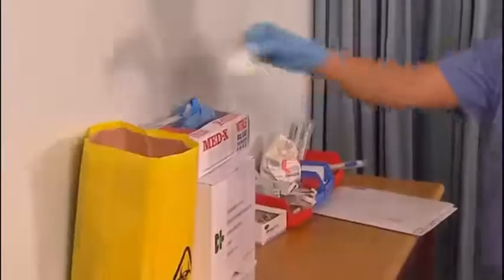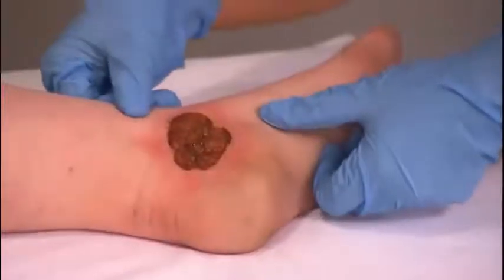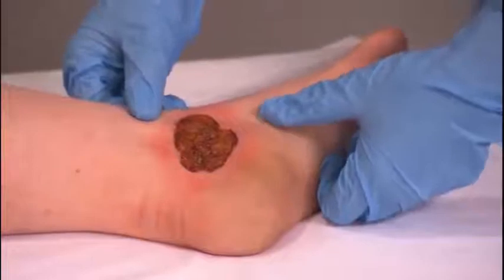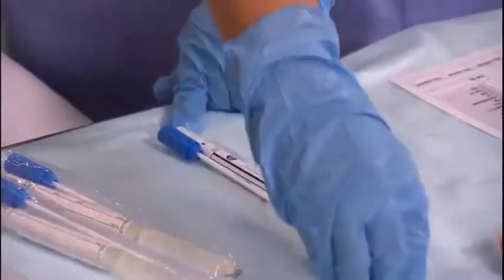Remove and discard any dressing. Inspect the wound. Note the color, odor, and the presence of any exudates. Open the sterile swab packet.